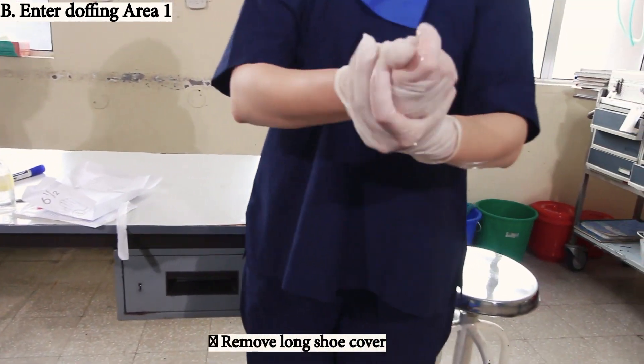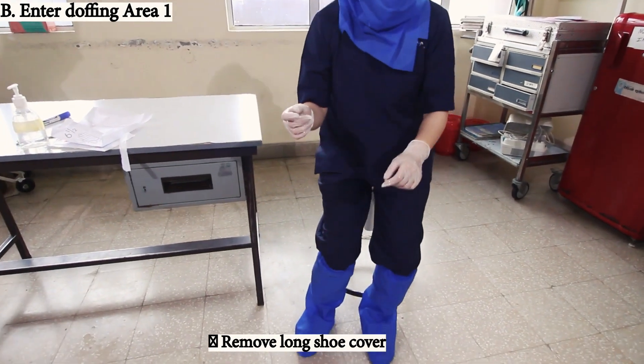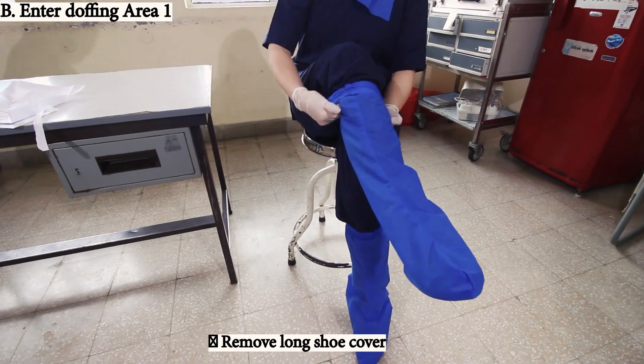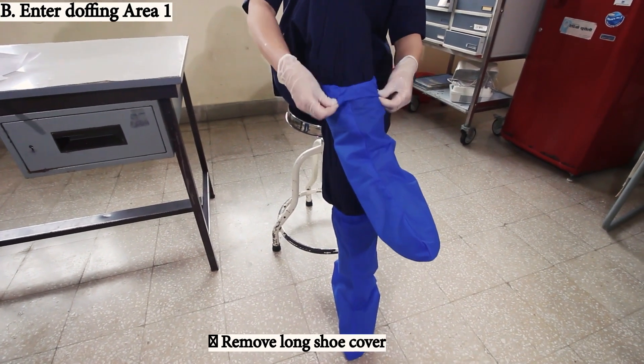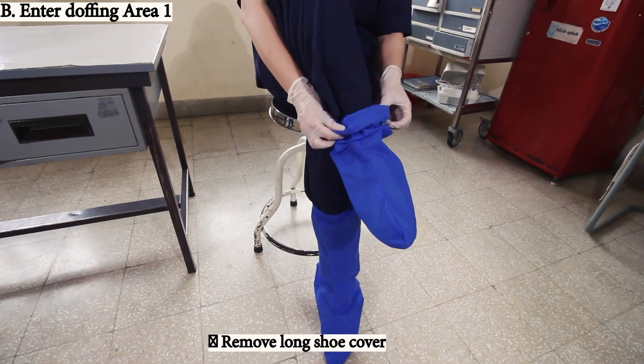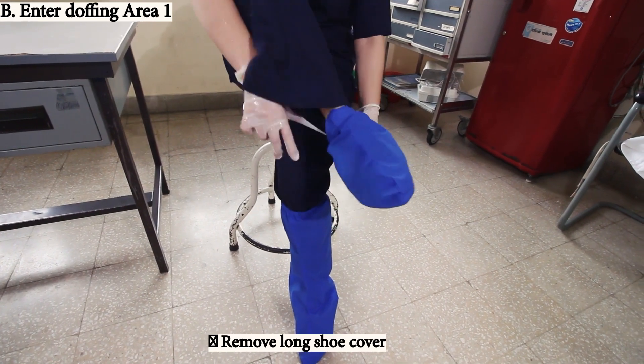Remove the long shoe cover. Roll it inside out. Then remove the hair cover.